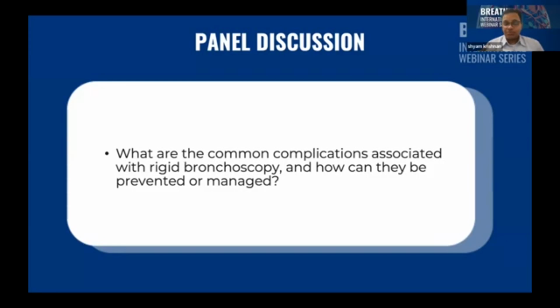And always, especially after a procedure, post the patient for a post-procedure check bronchoscopy the next day. Especially if you place stents or do procedures in the trachea, there's always a chance of pseudomembrane formation, which can also cause the patient to land up in stridor or respiratory distress. So try to post the patient for a check bronchoscopy the next morning and see if there is a lot of mucosal necrotic slough which is sloughing off and obstructing the bronchus or can cause pseudomembranous flaps. So all those flaps need to be removed.